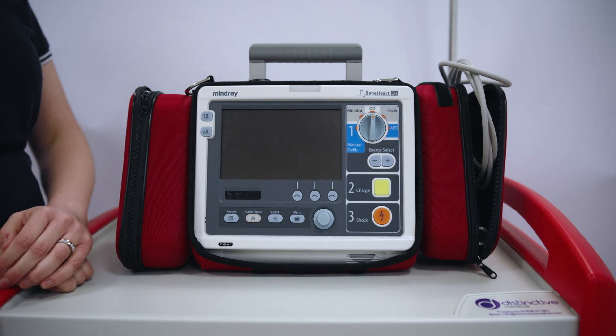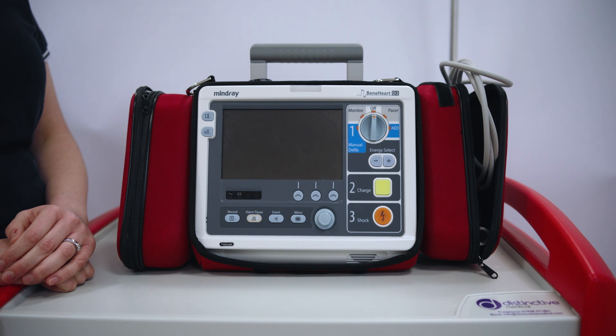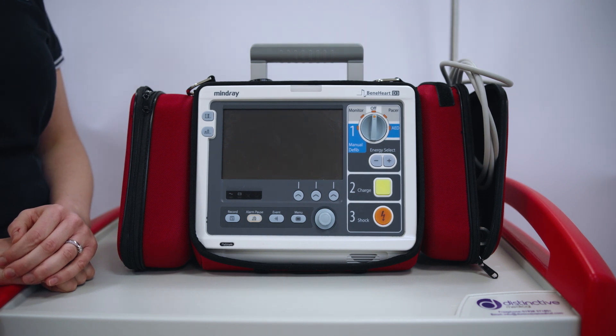This is our D3 defibrillator. You'll find these in Allenbrae unit, Theatres and SAPU. I'm just going to go through some of the functions of the D-fib.